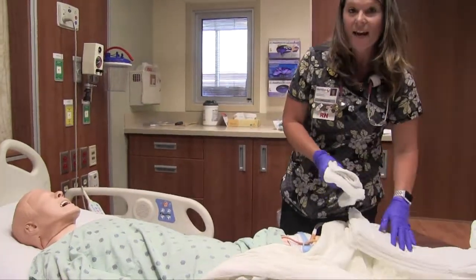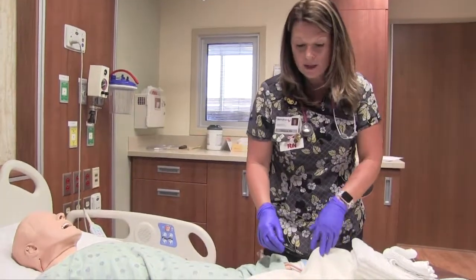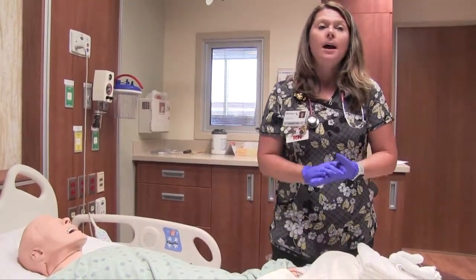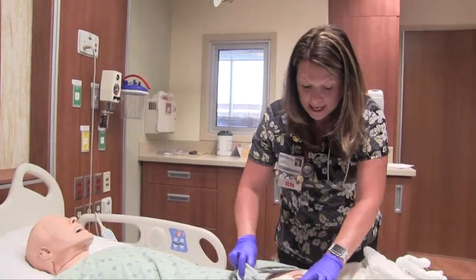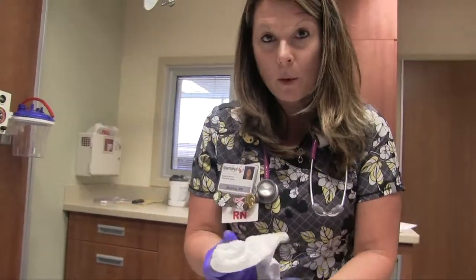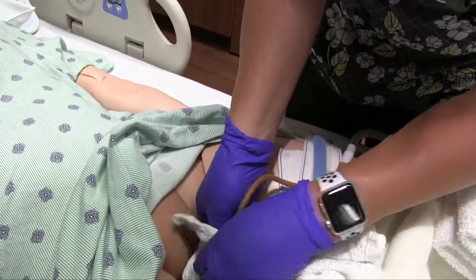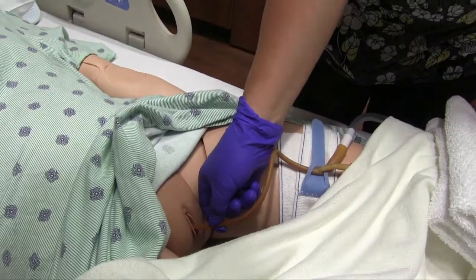so twice a day and after every single bowel movement, you're going to need to do what's called catheter care. So when you do that, you use like a mild soap and water. I don't suggest anything with fragrance because you are kind of open, and some people do get some irritation with that. So twice a day, you're going to use a good soapy wash rag, and you're going to clean the area very well. Soap and water. Get rid of that rag.